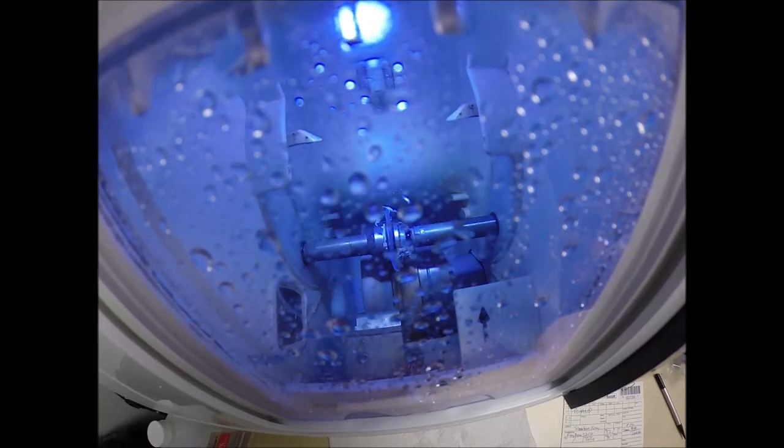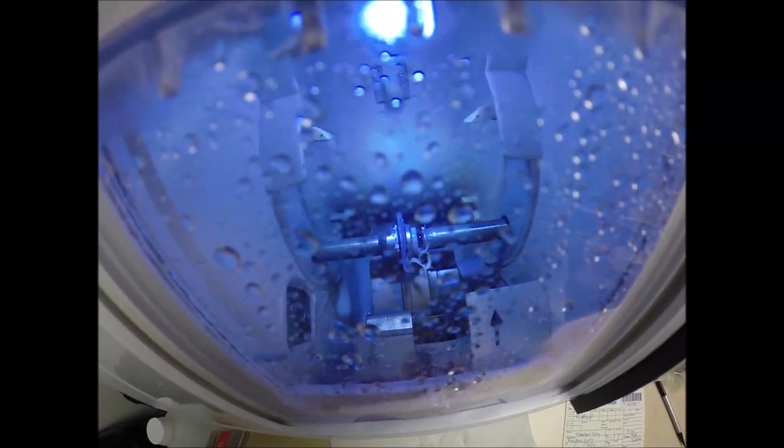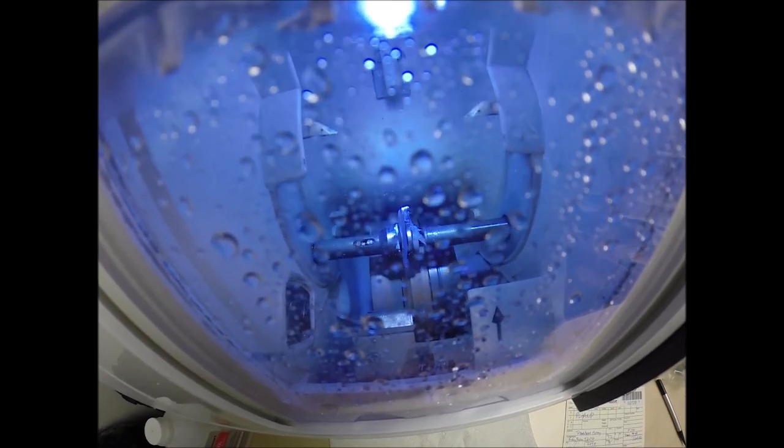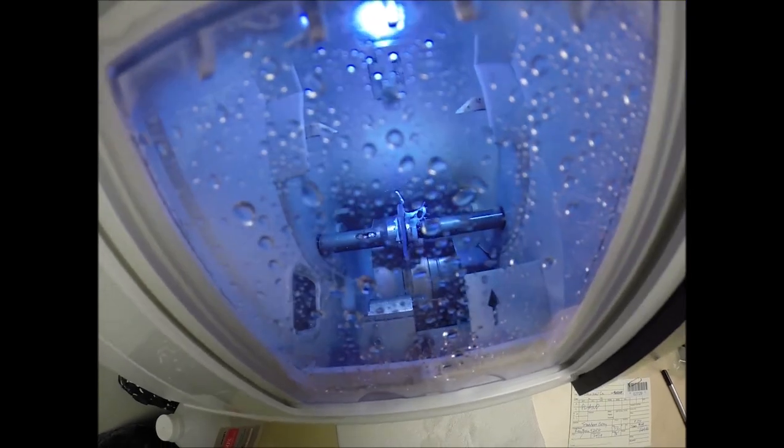Ooh, look, there's some optical sawdust, some Schwarf on the edge of your lens. May the Schwarf be with you. But it's not, because pretty soon some water is going to spray on there and wash it all off. You ain't even getting any Schwarf, Jose.